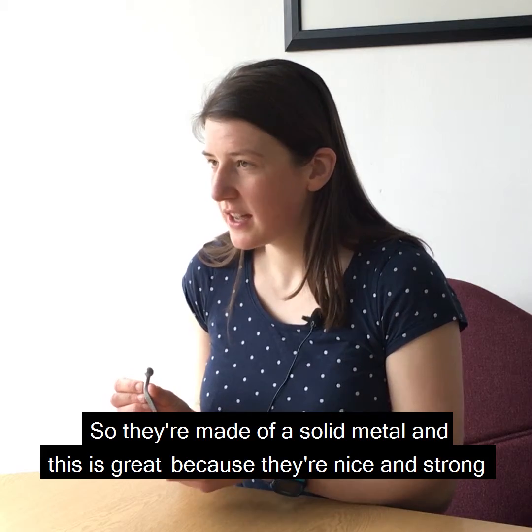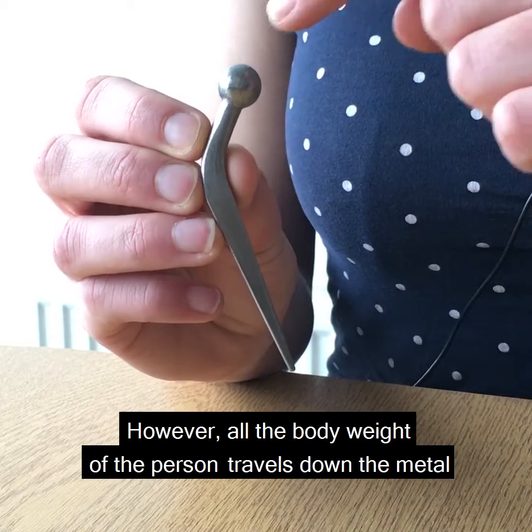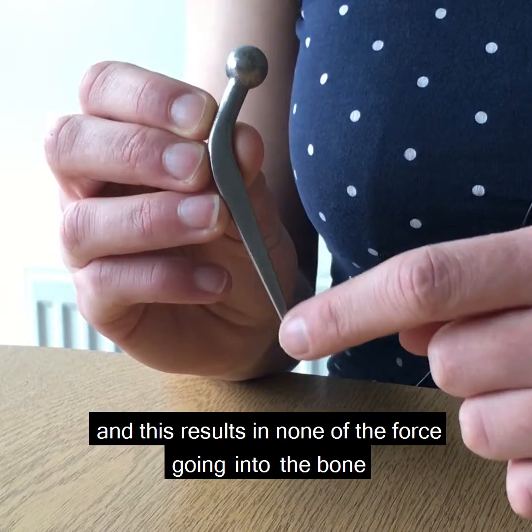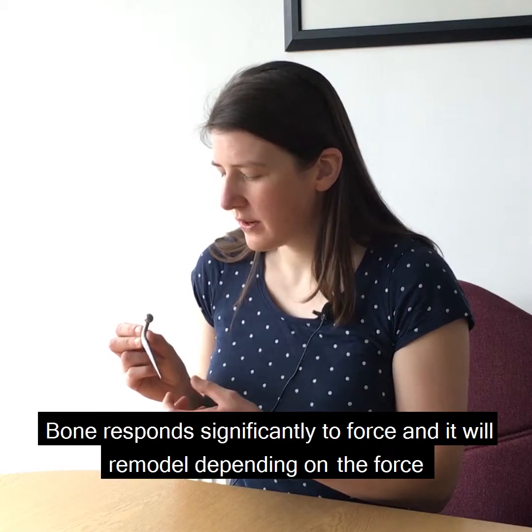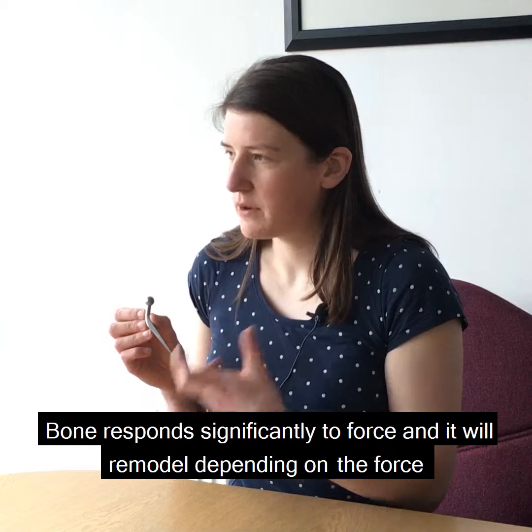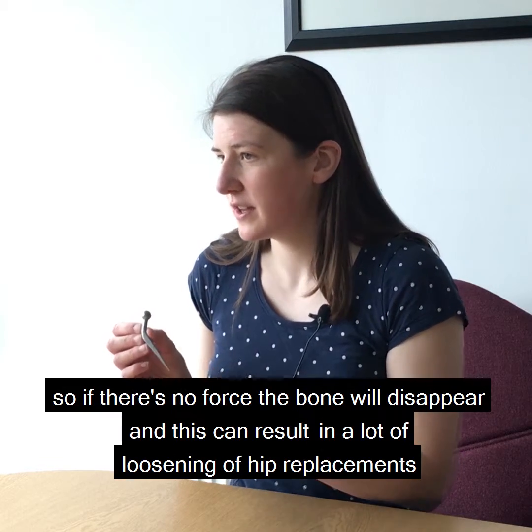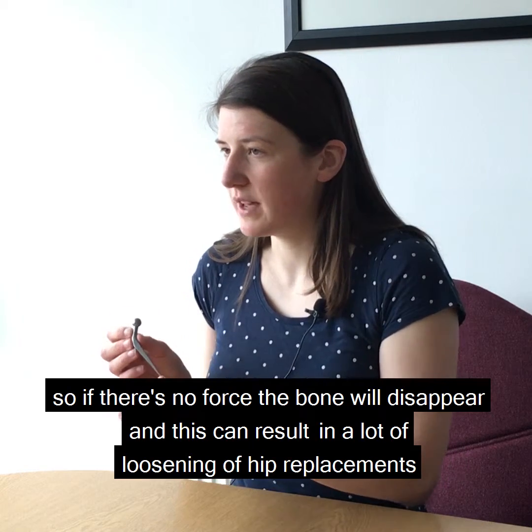So traditional hip replacements look like this. They're made of solid metal and this is great because they're nice and strong. However, all the body weight of the person travels down the metal and this results in none of the force going into the bone. Bone responds significantly to force and will remodel depending on the force, so if there's no force, the bone will disappear and this can result in a lot of loosening of hip replacements.